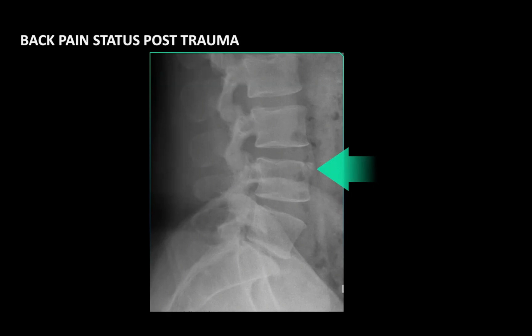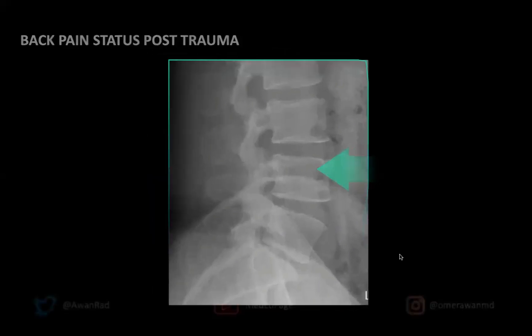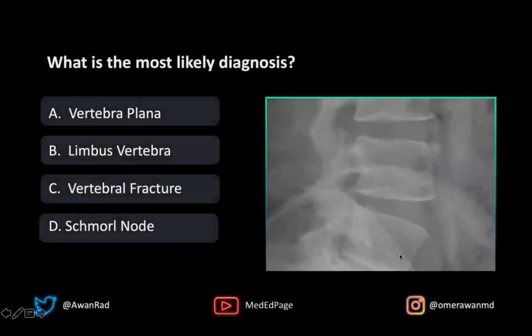This is a patient that's had back pain, status post-trauma. We have a cone-down view of the lateral lumbar spine with an arrow pointing at the L4 vertebral body. The question here is: what's the most likely diagnosis? Is this a case of a vertebra plana, limbus vertebrae, a vertebral fracture, or a Schmorl's node?